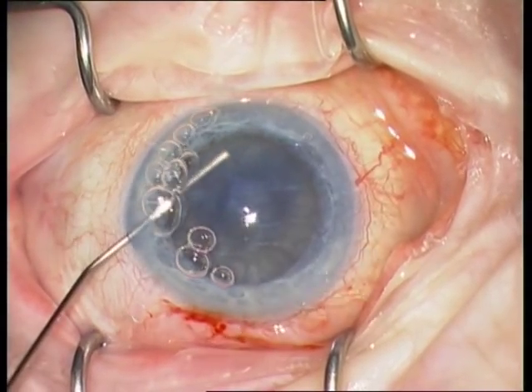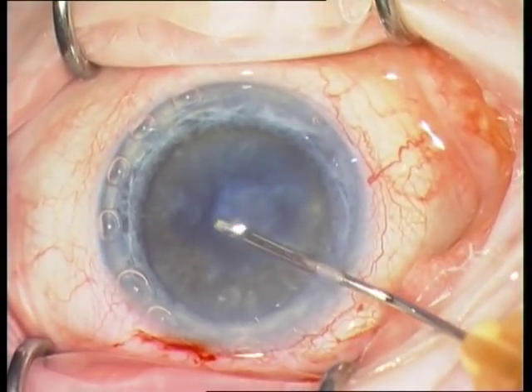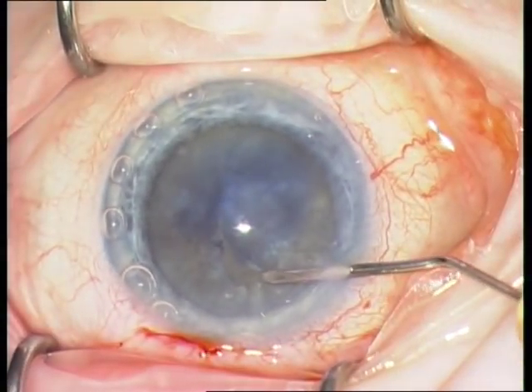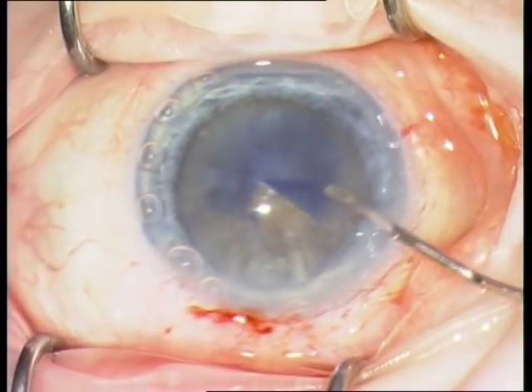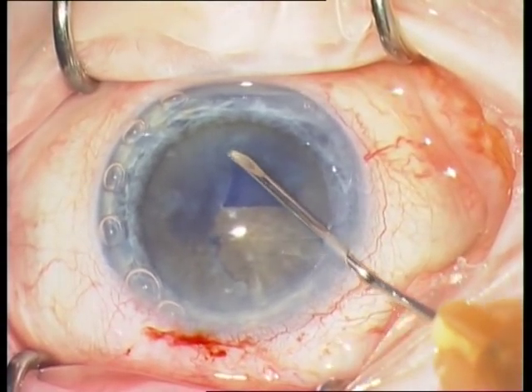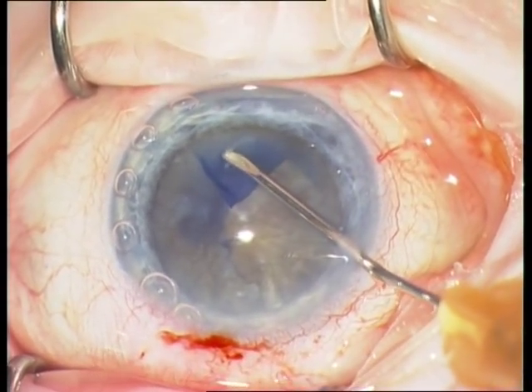The anterior capsule is stained with Vision Blue. Then the rhexis is performed. Important for the rhexis is that you perform a large rhexis — in order to luxate the nucleus out of the lens capsule. If the rhexis is too small, you will fail to luxate the nucleus out of the lens capsule. Therefore, perform a large rhexis.